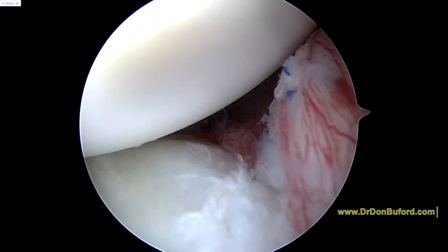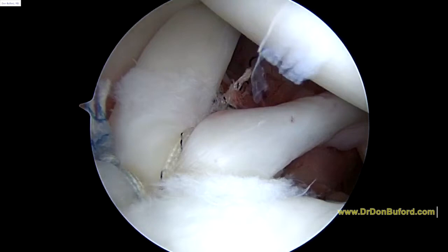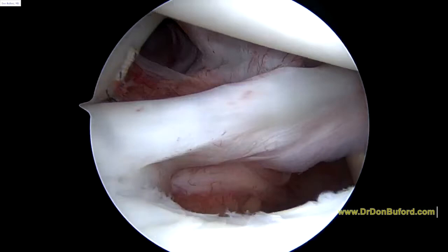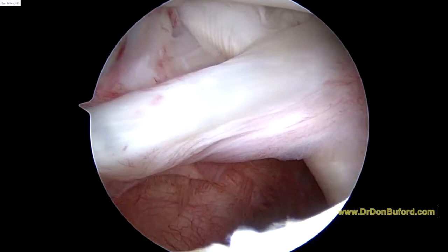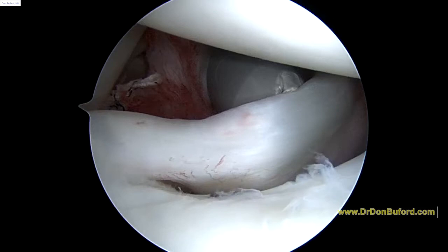So I'm very happy with the work that we've been able to do back there. Now we're going to finish the job here in the front. So we've got the second suture tied. You can see how we don't put anything down to reattach this middle glenohumeral ligament because that's basically normal anatomy and we don't want to over-tighten the shoulder. We know that if we were to repair this as if it was a Bankart, that would cause a lot of shoulder stiffness — so we're purposely not doing that. That would be a tactical error in my opinion.